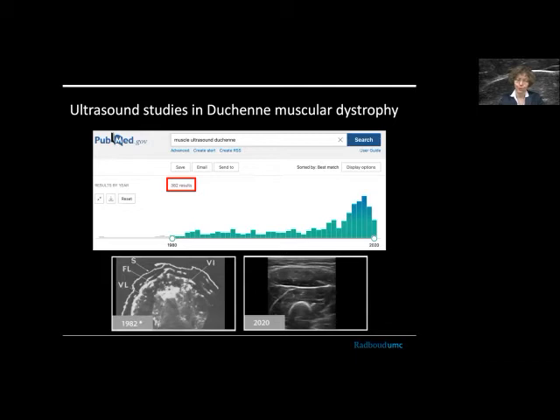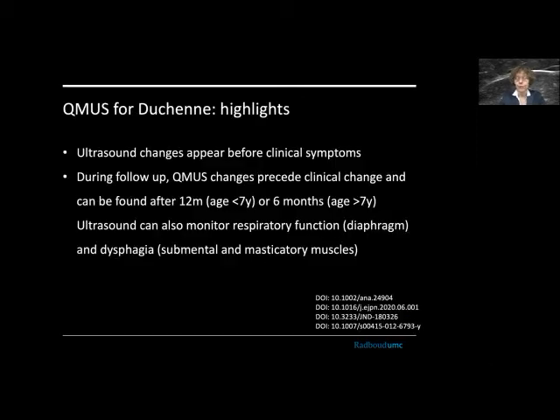So to me, these first images of the quadriceps look like sonar looking at the floor of the sea. But right now we have very nice tissue resolution. So there's been a lot of improvement in technique over the years. Now, because it's too much to show you all 382 papers, these are the highlights, and I've selected a few of them. And I think the good thing to know is that the ultrasound is very sensitive to pathology in these classic neuromuscular disorders.